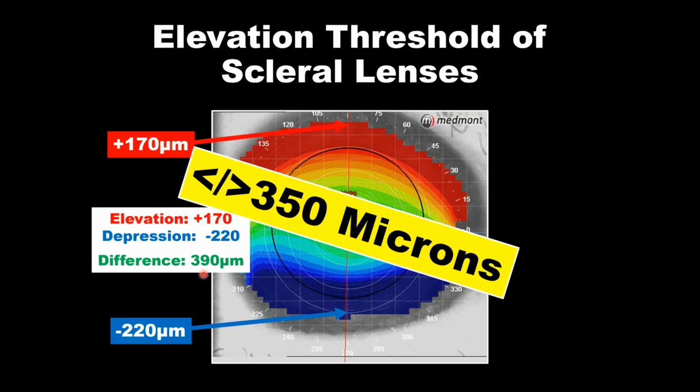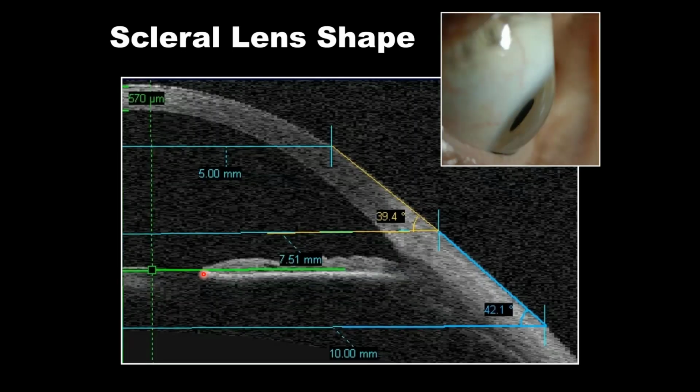Now, of course, if the patient has an incredibly deep set eye, or if you would expect that handling, application and removal is going to be a problem for the patient to manage because they're a first-time contact lens wearer, then of course try a corneal GP. But use this 350 microns as a guide to direct where the decision-making may be the best. What is the likely lens of first choice going to be?